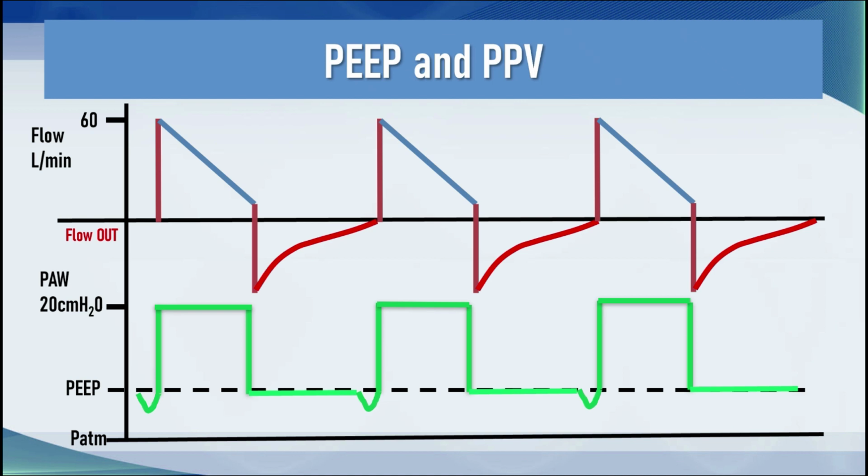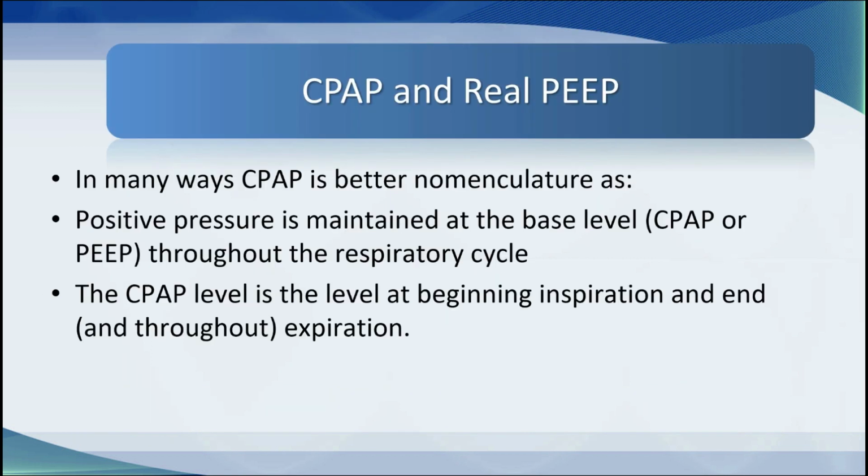The ventilator triggers from that pressure so that the real driving pressure is the peak or plateau pressure minus the PEEP minus the negative pressure deflection. Hence, the mean airway pressure will actually be lower in this setting because the breath doesn't start at PEEP, it starts below PEEP from the point in the airway pressure that is generated by the negative pressure within the pleura. So a spontaneous breathing patient on pressure control, for example, or pressure support will have a lower mean airway pressure for the same level of PEEP.